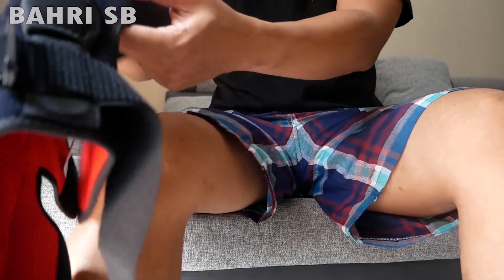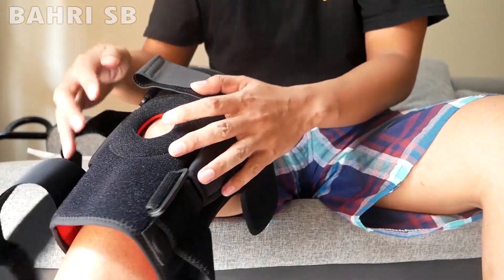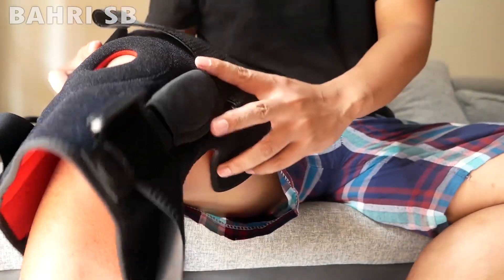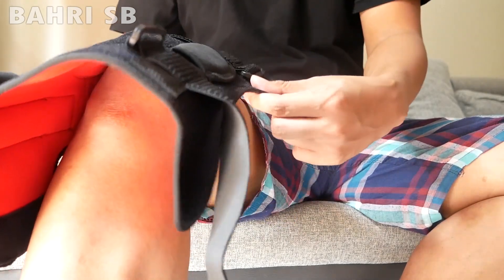Oke, langsung aja, sekarang saya akan pasang di lutut sebelah kanan, karena memang kemarin setelah sehabis main badminton terasa keseleo atau ketarik.